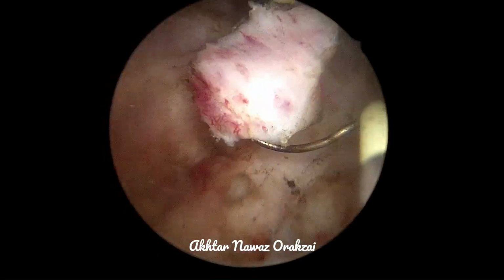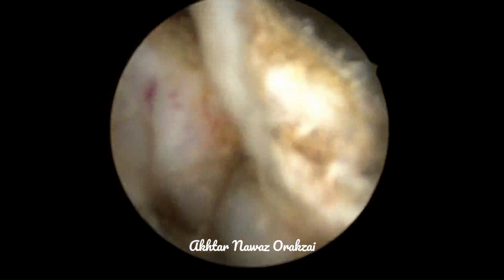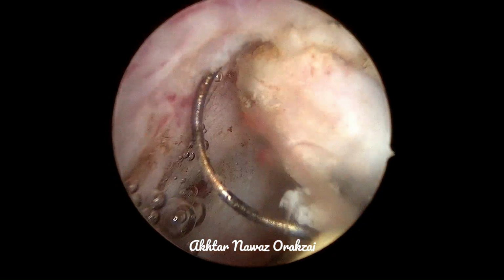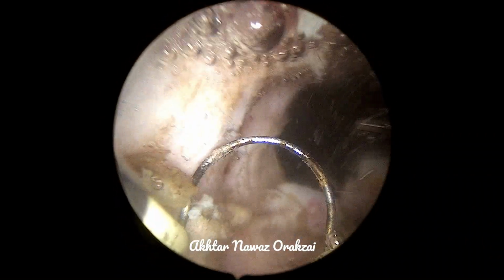So now you can see very nicely the prostatic cavity is wide and open. You can see the area of the breach in the capsule here.